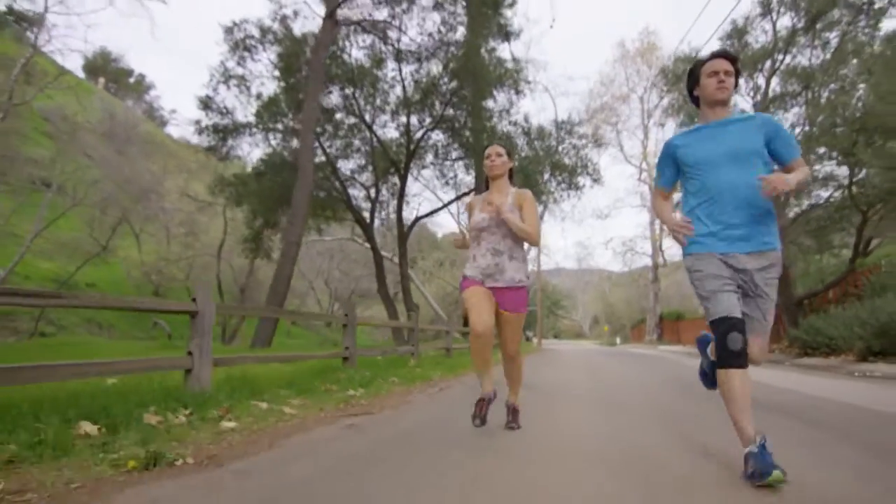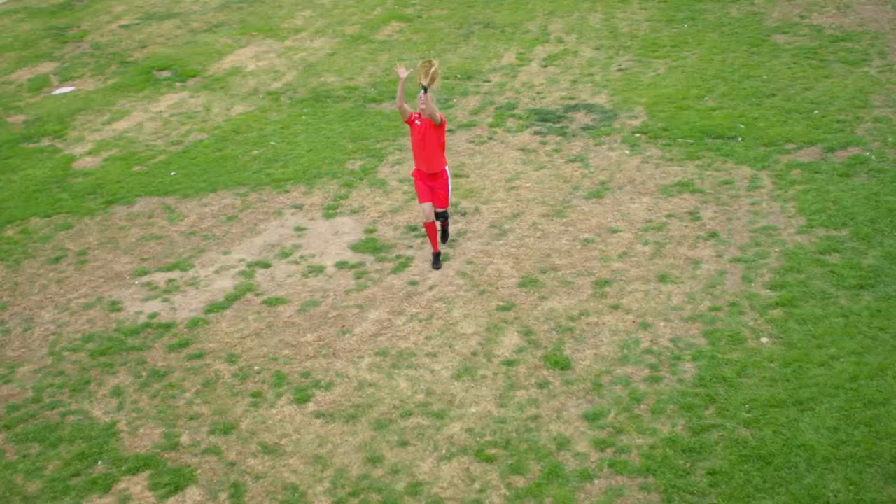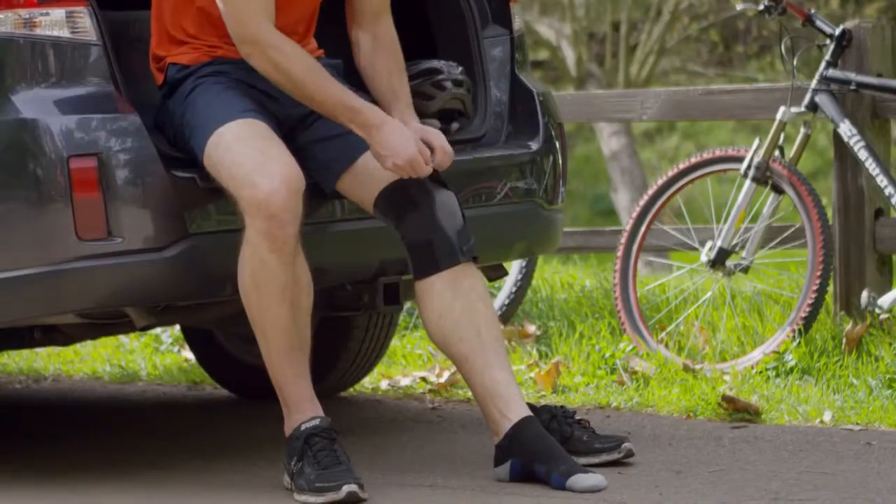Welcome to the FreeSport Sleeve Knee Brace for your innovative patellofemoral support. We know there are so many activities you can do, and Bregg is happy to support you along the way. Let's take a few moments to familiarize you with some of the key features of the FreeSport Sleeve Knee Brace and show you how to properly apply your new knee sleeve.